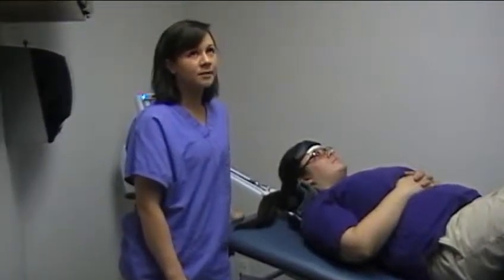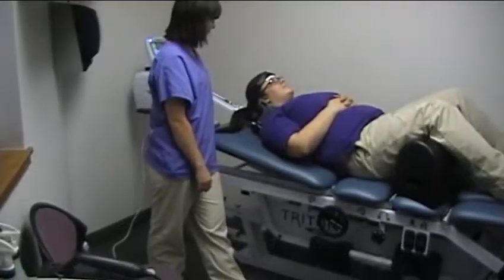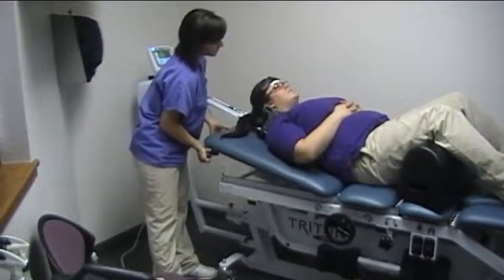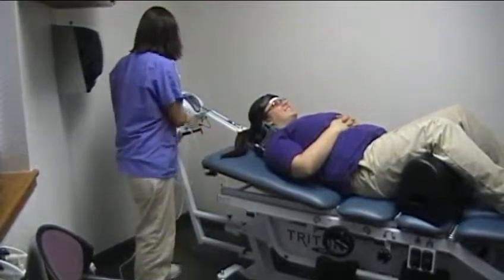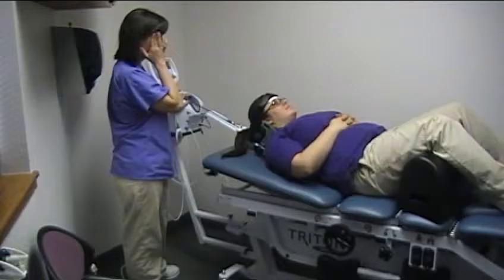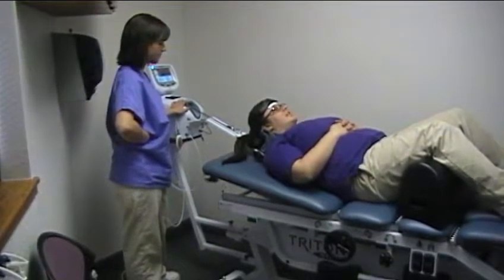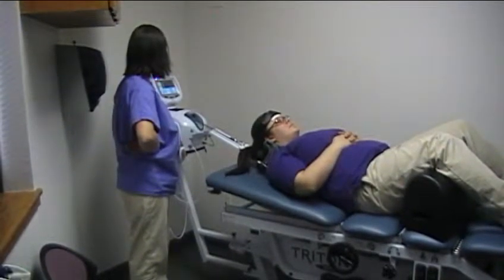The patient may say it's good, but you can move the bed around to see how they're feeling. Ask: does it feel better moving up, or does it feel better where it was? You can also move it up and down. Then try increasing the poundage just a couple pounds to see if it feels better that way, or if the patient prefers less.